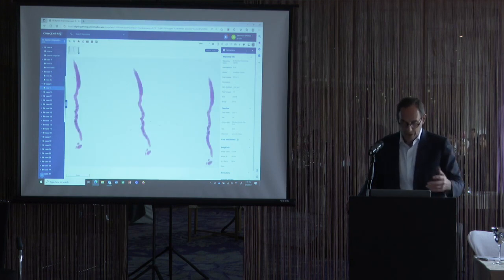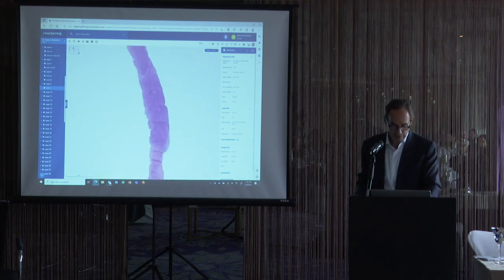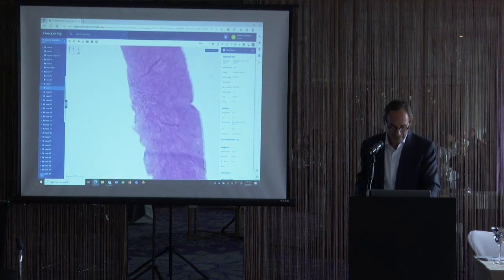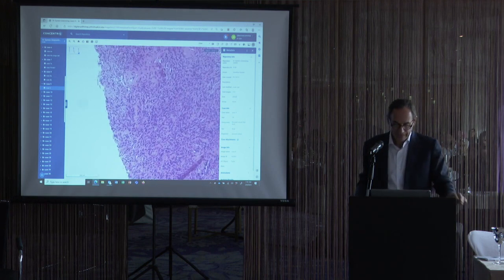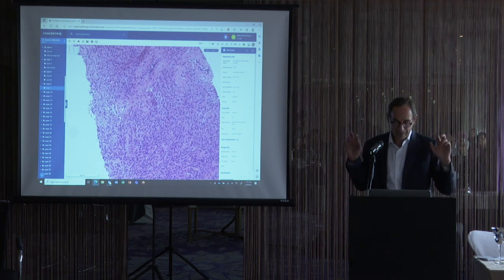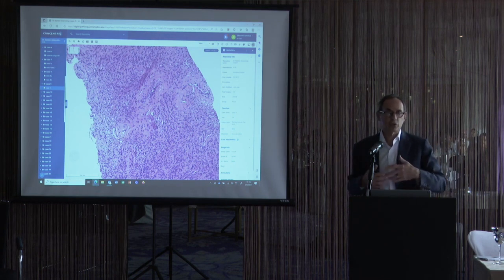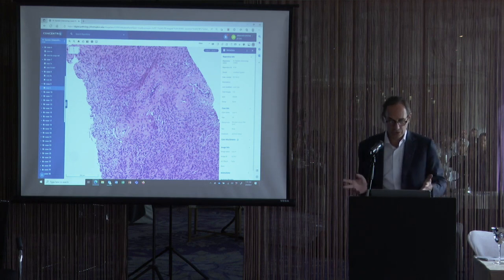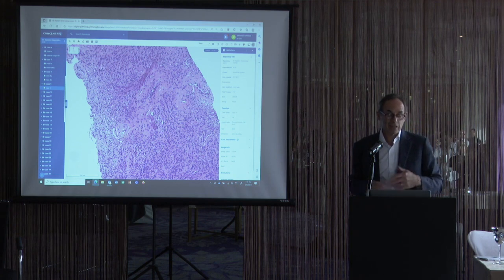This is one of the more common stromal lesions I see on a prostate biopsy. What we have here is a very cellular stromal lesion, and this is one of the most common mesenchymal lesions I see in consultation. The common and reasonable question is: is this a stromal tumor? A stromal tumor of uncertain malignant potential, a STUMP? Is it a stromal sarcoma? Is it a leiomyosarcoma? All this is stromal BPH, and that's why I see it commonly, because stromal BPH is common.